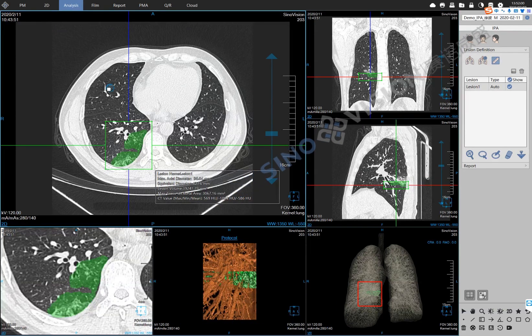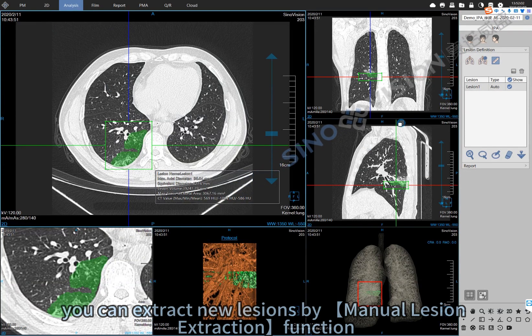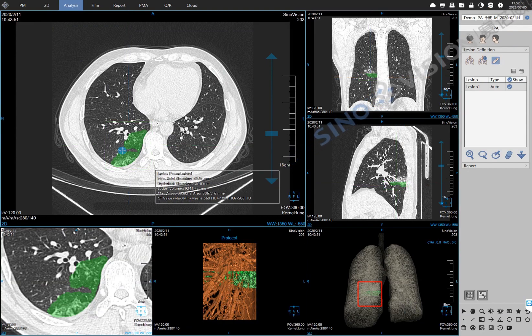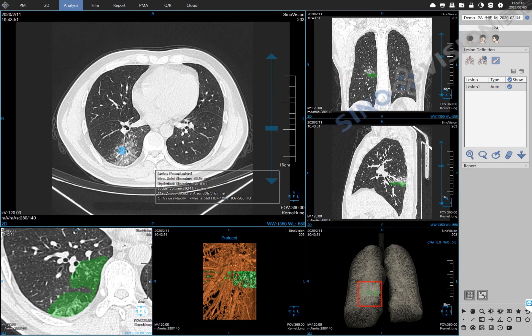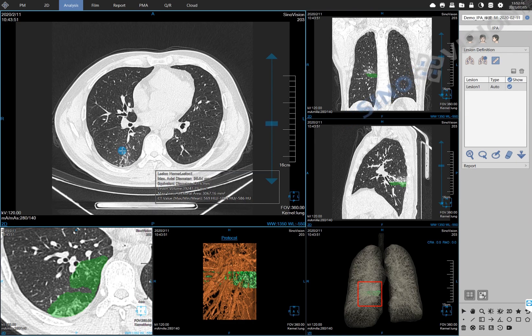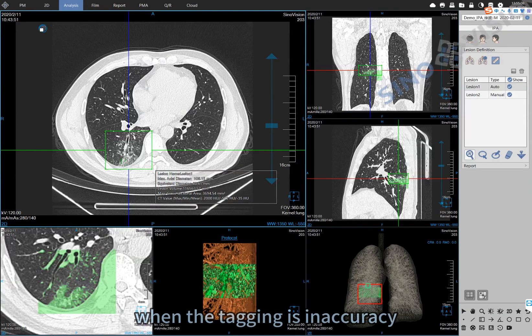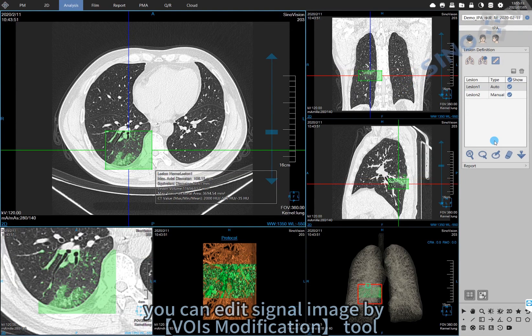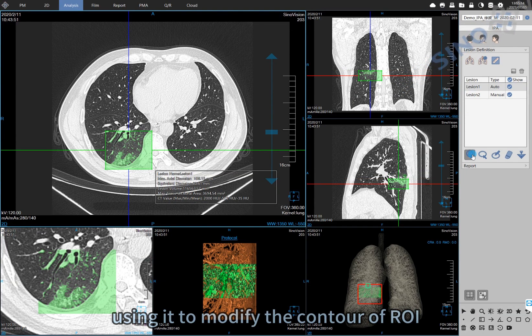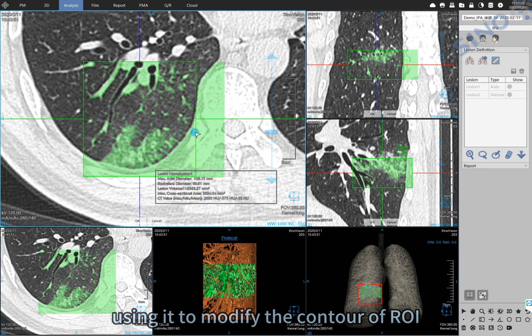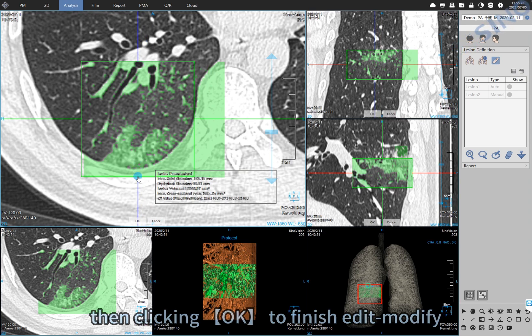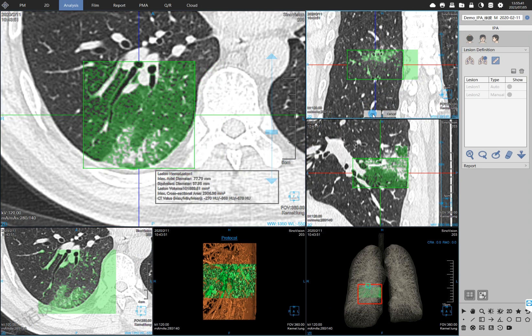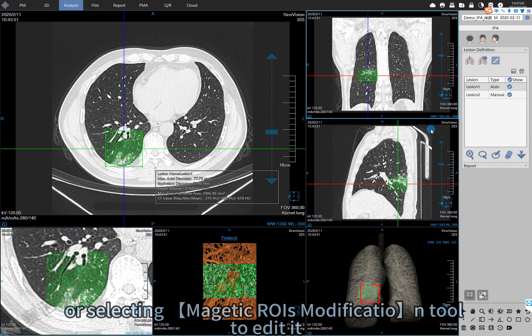When there are missing lesions, you can extract new lesions using the manual lesion extraction function. When the tagging is inaccurate, you can edit a single image using the VOI modification tool, using it to modify the contour of the ROI, then clicking OK to finish the edit. Alternatively, select the Magnetic ROI modification tool to edit it.